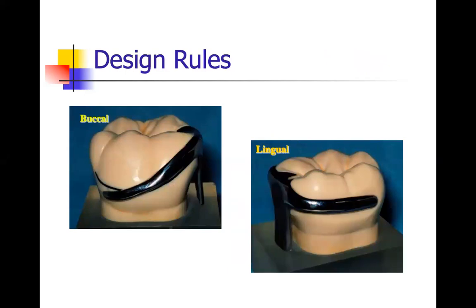The clasp should arise from the main body of the clasp assembly above the height of contour. The retentive arm should extend cervically and circumferentially in an arcing manner.